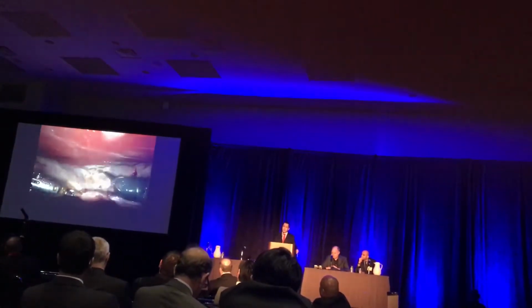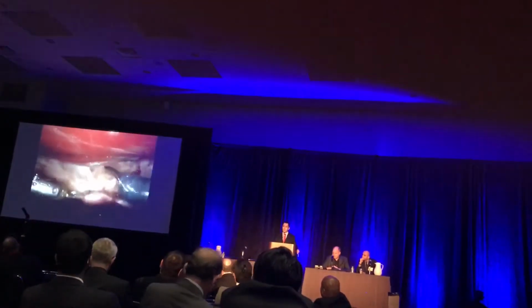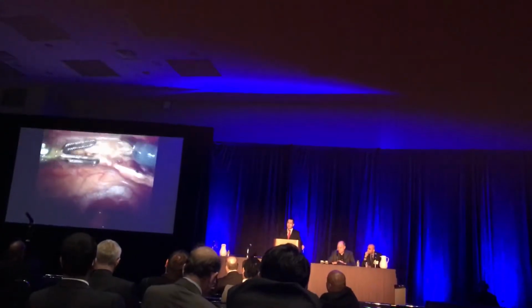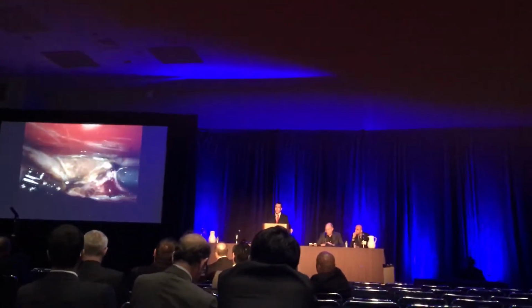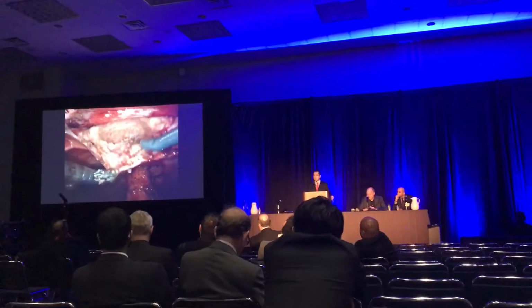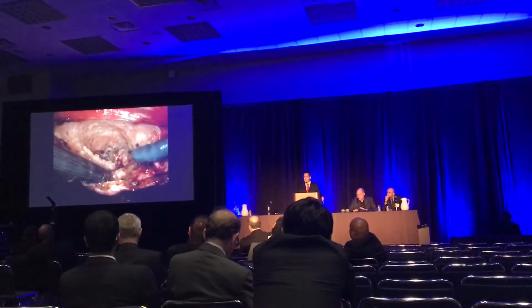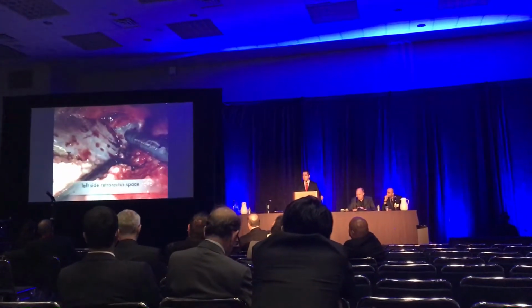Then the surgeon proceeds into the midline defect, which this patient had, protecting the hernia sac, again to allow for full coverage of the mesh. This picture shows from both sides of the dissection the space that is being created and its relation to the parastomal hernia and the ostomy you can see in the background.